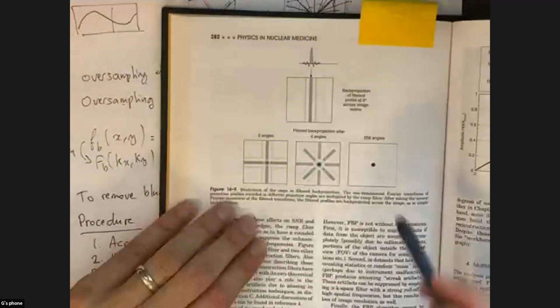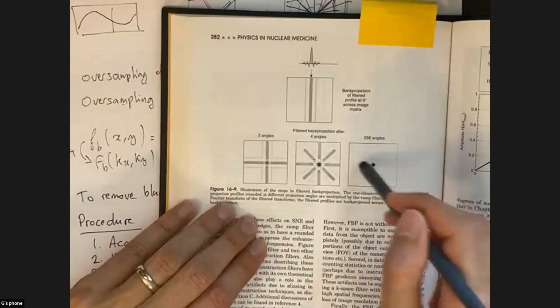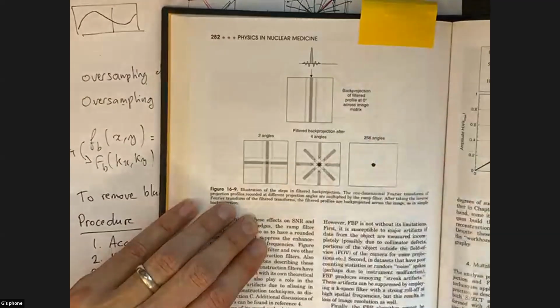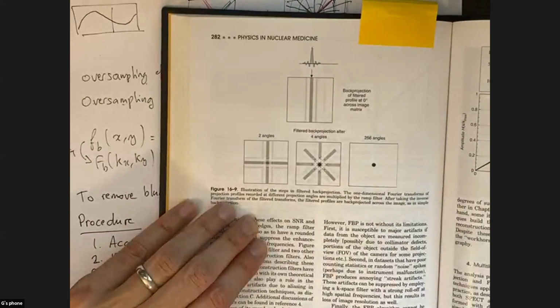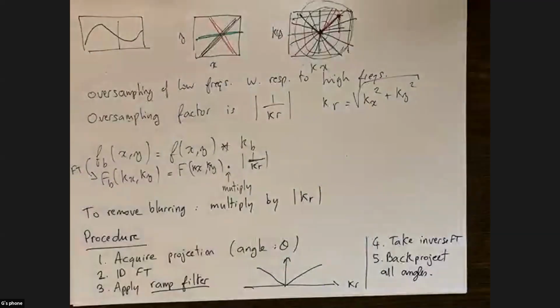And so when all the multiple views are being added up, all the counts that were recorded here cancel out with those negative wings around. The negative wings are really designed to give you the desired outcome. So that's the procedure.